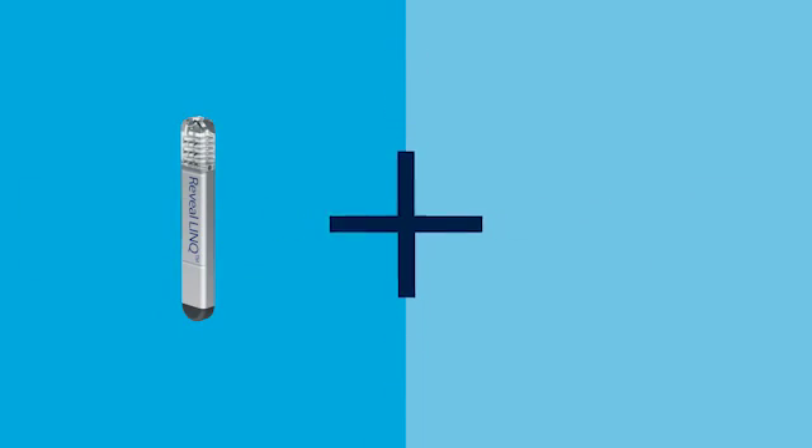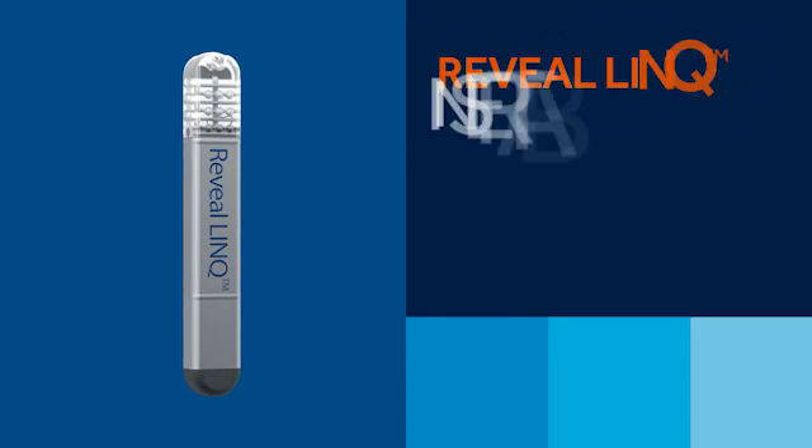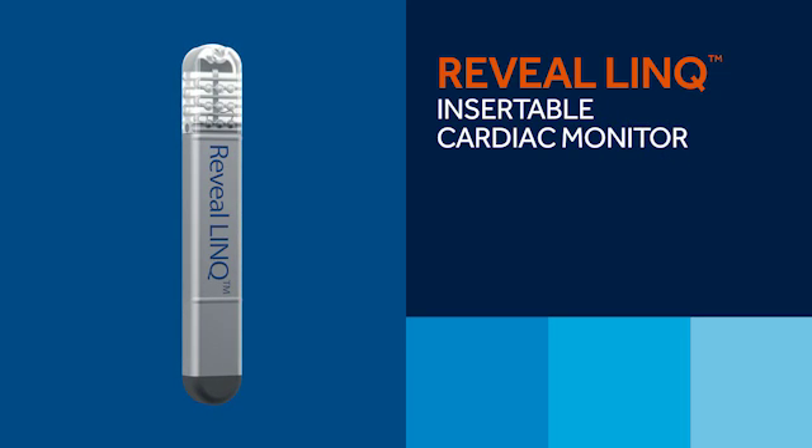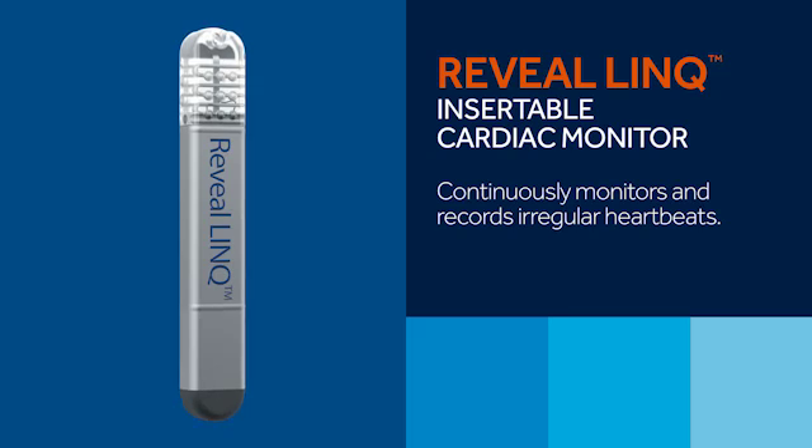Now, let's review the components of the system and how they work together. The system has two primary components needed to capture heart information and send it to your doctor. The Reveal Link Insertable Cardiac Monitor, or ICM, continuously monitors and records irregular heartbeats.